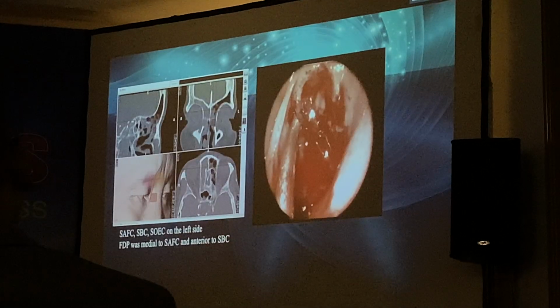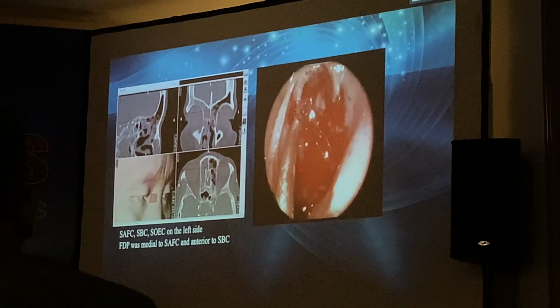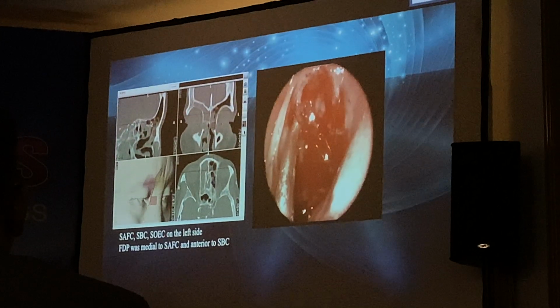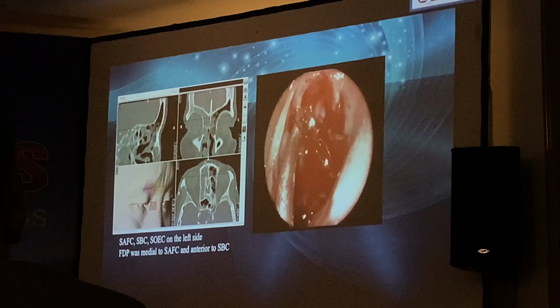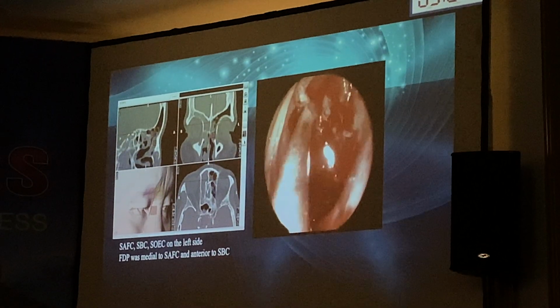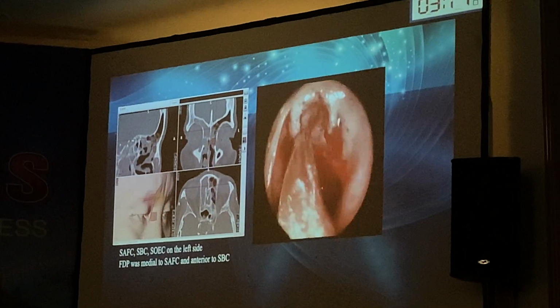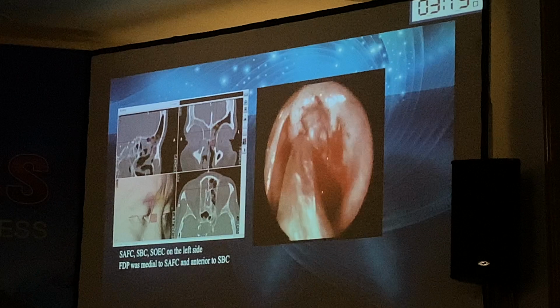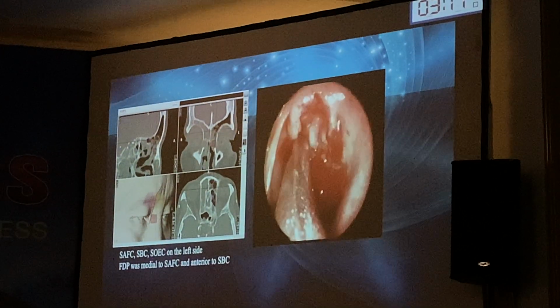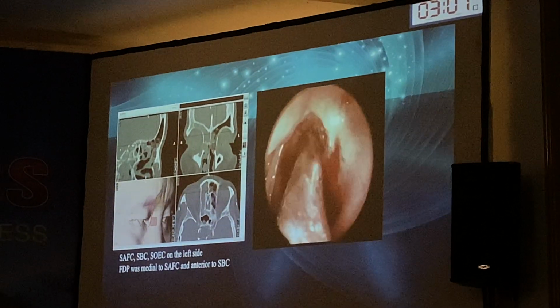Okay, so another case, we have here the agger. This is the supra-agger frontal cell, suprabullar cell, and SOEC. In this case, we use the software to identify the frontal drainage pathway. It's medial to the supra-agger frontal cell and anterior to the suprabullar cell.